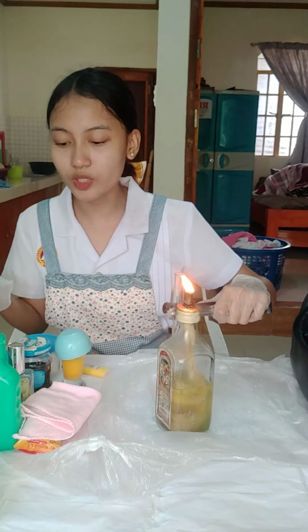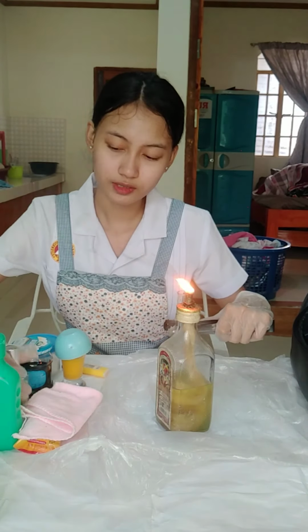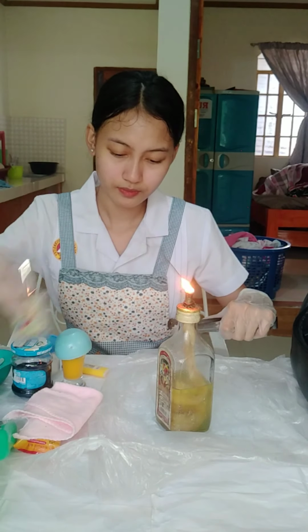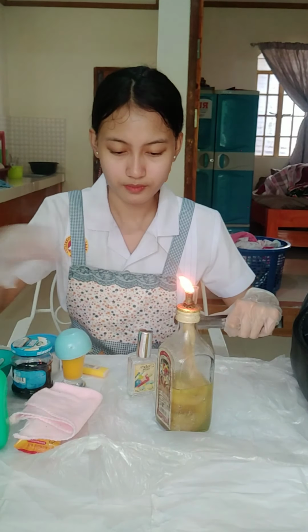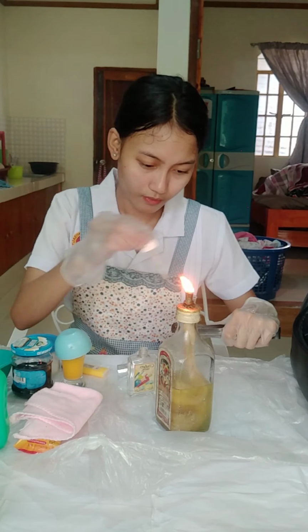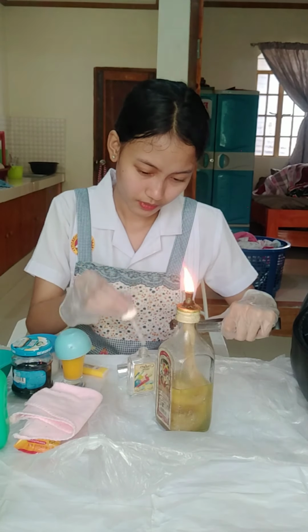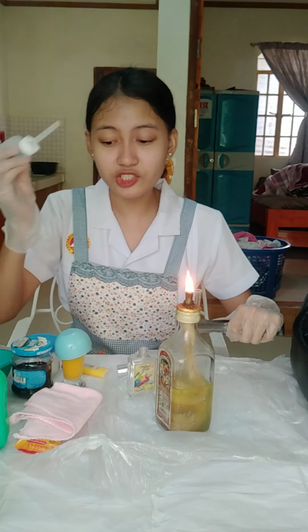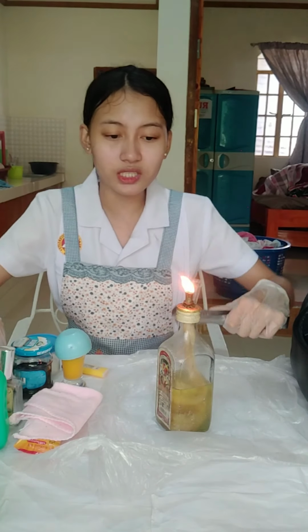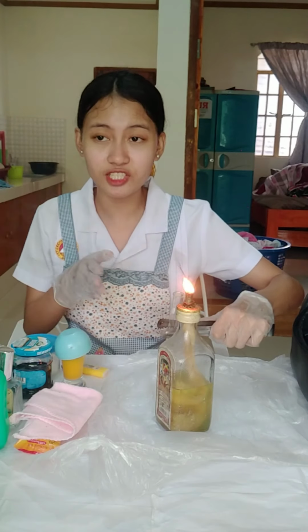And then after that, we need to add 5 drops of 10% acetic acid using the dropper. And then place the dropper on the waste receptacle. And then after that, hit it again. And then after that, note if there is a change in color.